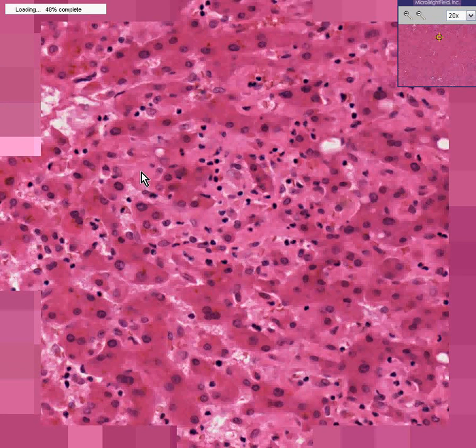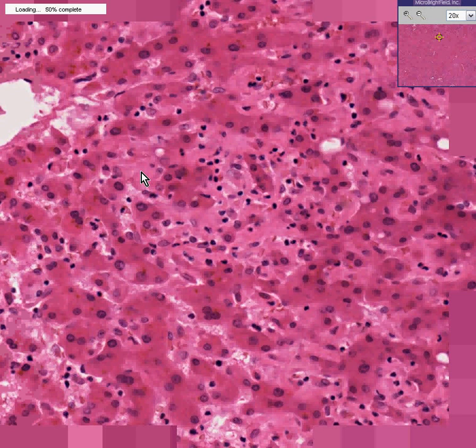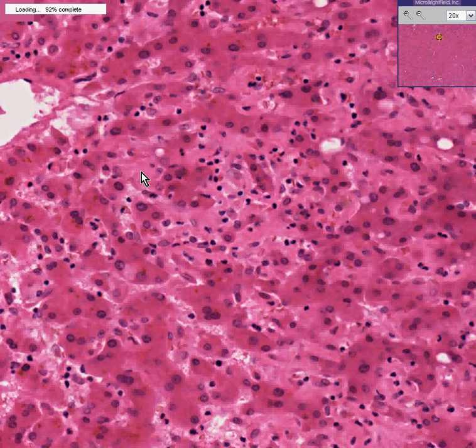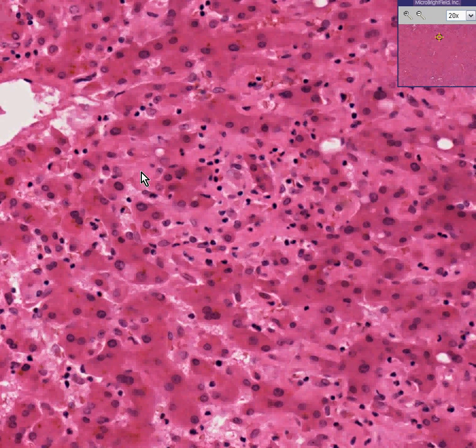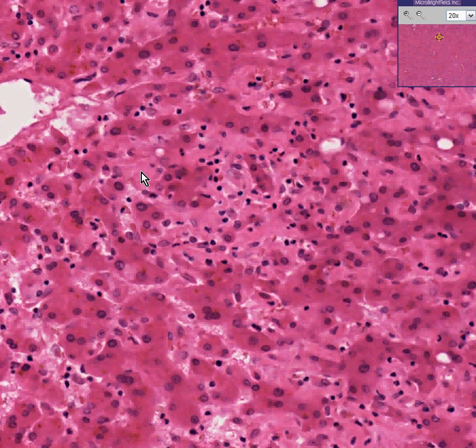And by definition, that's hyaline. Hyaline could be a lot of things. It could be fibrin. It could be scar tissue. It could be foreign material. It could be protein. One thing that hyaline could be is also amyloid.